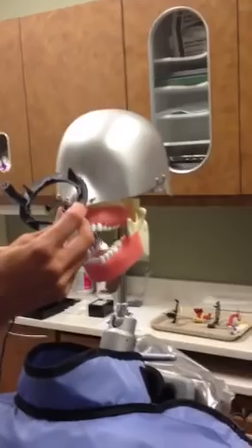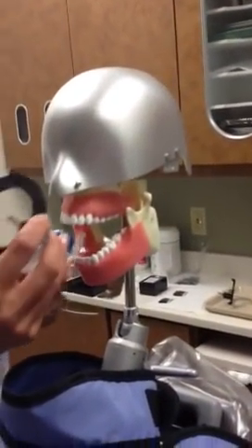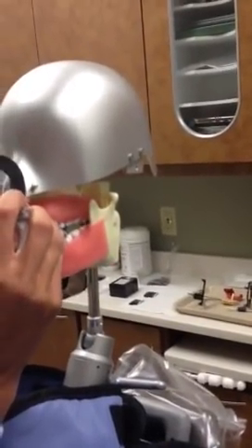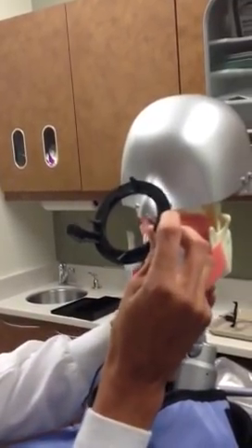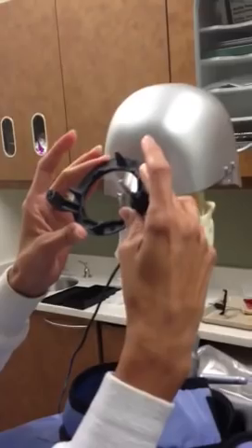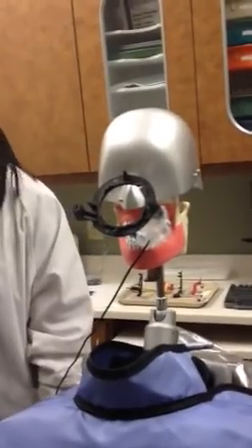Place the sensor in — we're using the long cone paralleling technique, so we want to make sure that it's far away from the tooth and as close to the middle as possible. Then we're going to have the client and the mannequin close down. Put this as close to the client's face as you can.